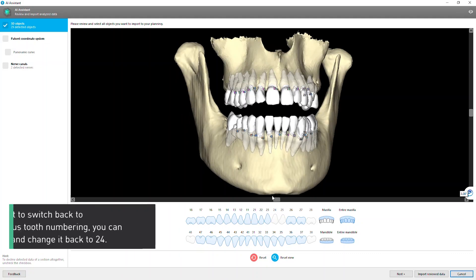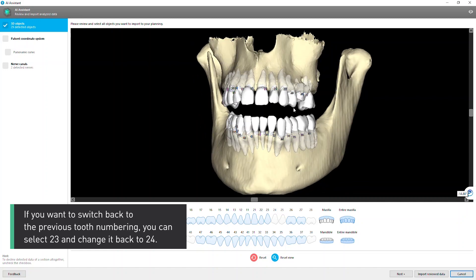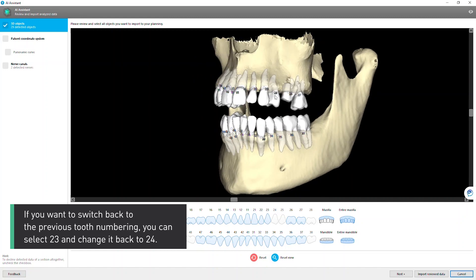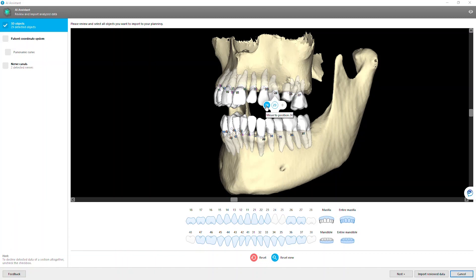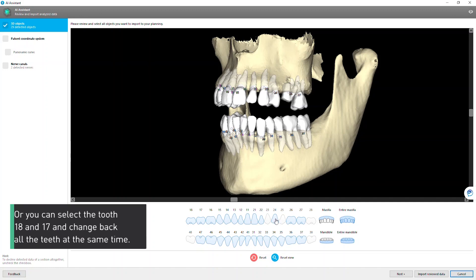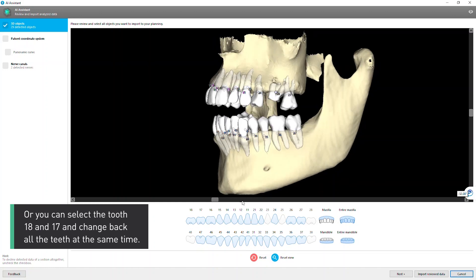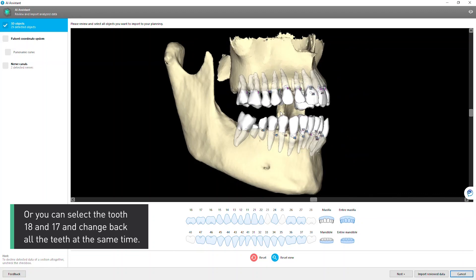If you want to switch back to the previous tooth numbering, you can select 23 and change it back to 24. Or you can select tooth 18 and 17 and change back all the teeth at the same time.